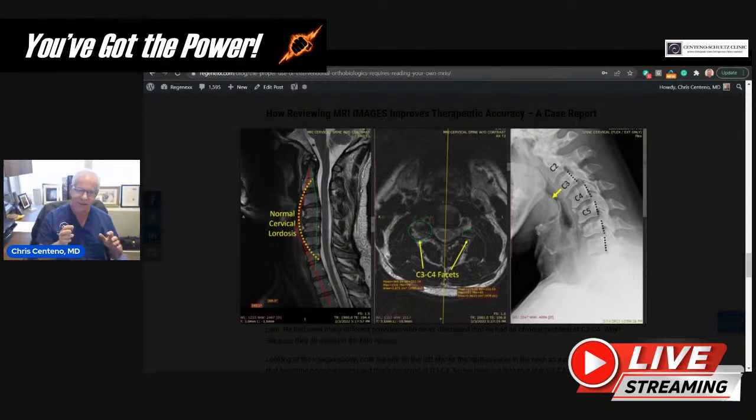So it's pretty easy to see that this particular patient has a problem at C3-4 in the imaging, which really hadn't been picked up before. Most people were telling him he didn't have a lot going on. Once you get to the next layer down, you can perform an exam and see whether or not that's really something that needs to be treated. And in this guy, it does.